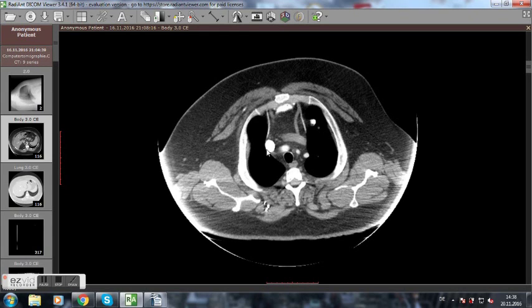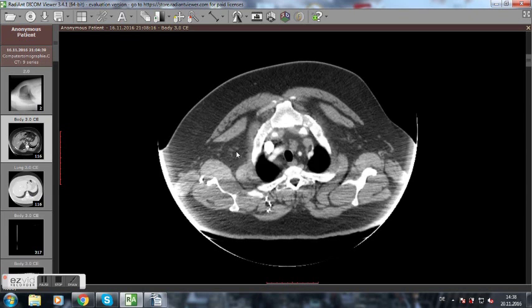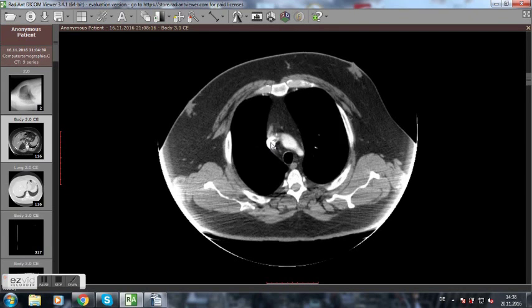we gave the patient some contrast agent, which is coming through the right arm. You can see it clearly here. This is the contrast agent, which is applied under pressure into the patient's right arm. So it's coming to this big vein. You can see here, this is this big vein, and it's called the superior vena cava, and from here it is going to the heart.